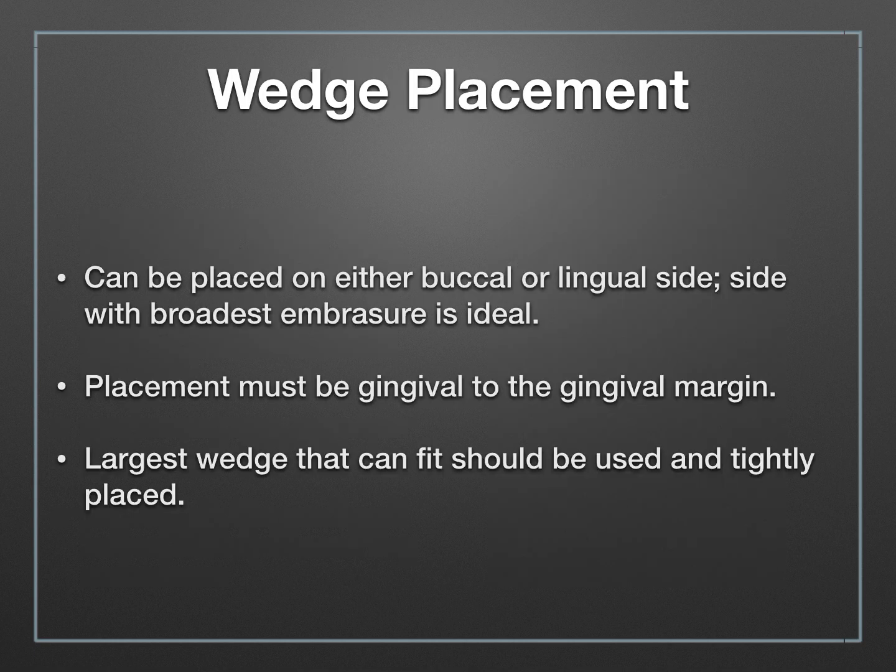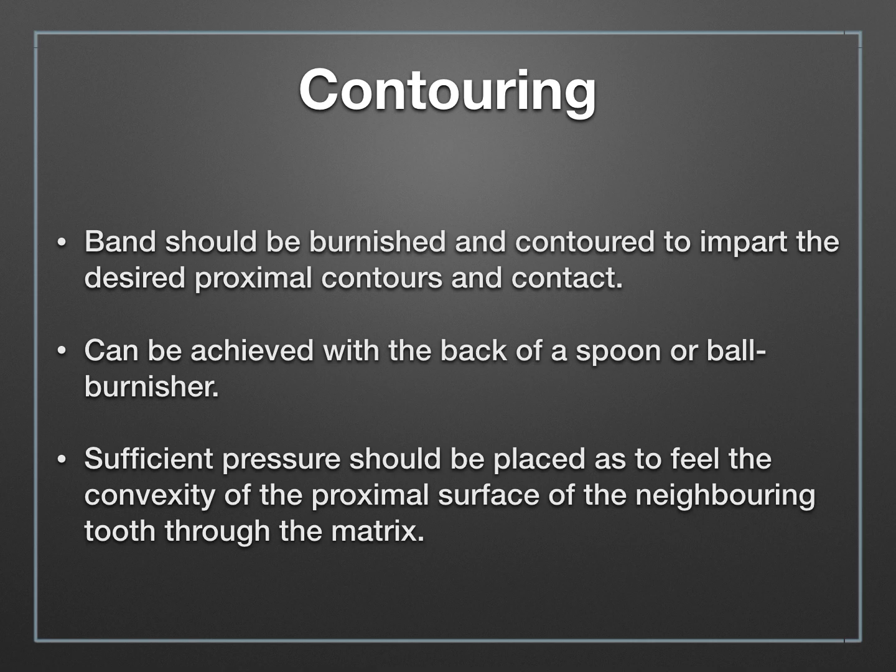The wedge can be placed on either the buccal or lingual side. It's ideal to pick the side with the largest embrasure, which generally tends to be the buccal, but either side is fine. The key thing is that your wedge must be located gingival to the gingival margin — if it's higher, it will cause an indentation into your box area, creating a funny contour to your restoration. Use the largest wedge that fits into your embrasure space. After the wedge is in place, contour the band and create a contact point by burnishing with a T-burnisher or ball burnisher, mimicking the size, shape, and location of the original contact point.